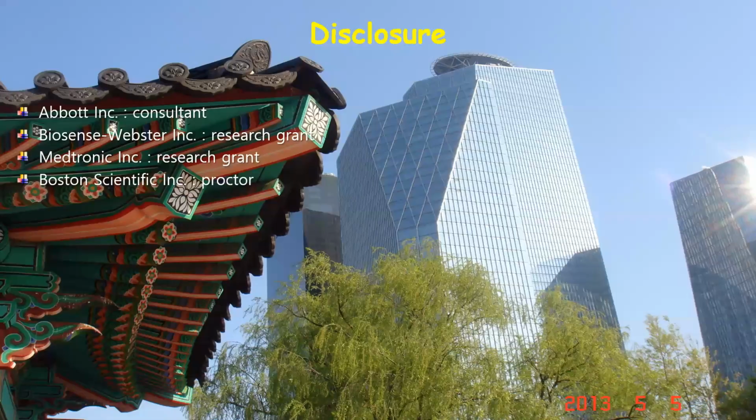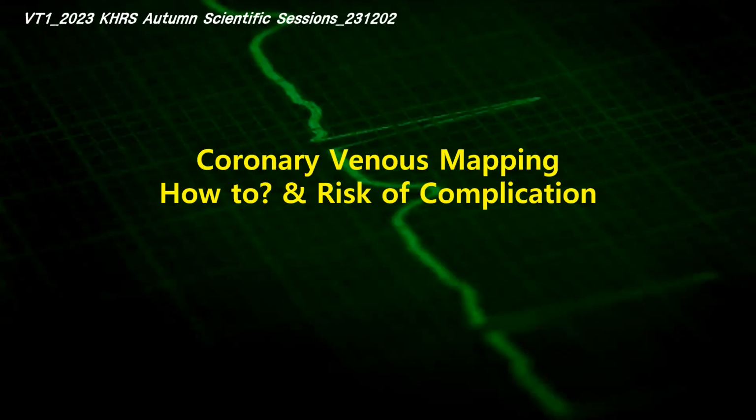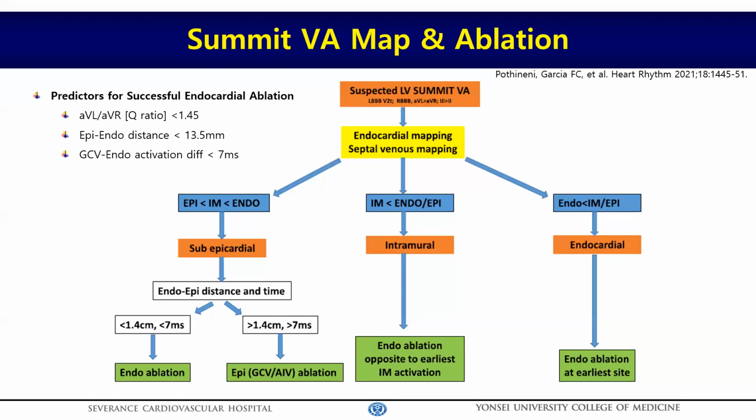My disclosure information. In this lecture, rather than reviewing others' papers, I would like to discuss the practical technique for LV summit ventricular arrhythmia mapping using my case examples. I believe the most efficient method for LV summit VT mapping might be the coronary venous mapping technique.